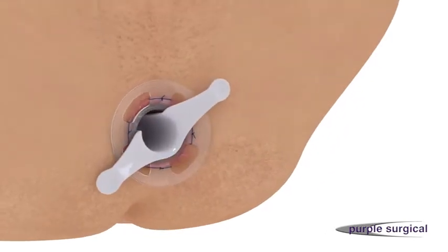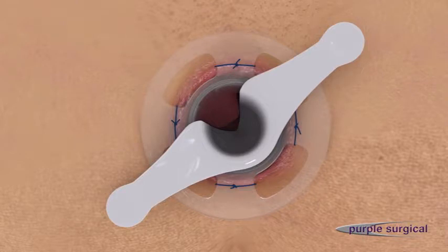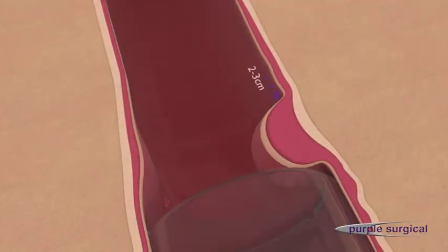Rotating the purse string suture anoscope while fully inserted within the clear anal dilator can twist the mucosa and result in an improper asymmetric purse string suture. The sutures must be placed at least 2-3 cm above the apex of the hemorrhoids, the distance to be increased in proportion to the extension of the rectal prolapse. Use a 2-O monofilament suture on a 25-30mm curved needle when creating the purse string suture.